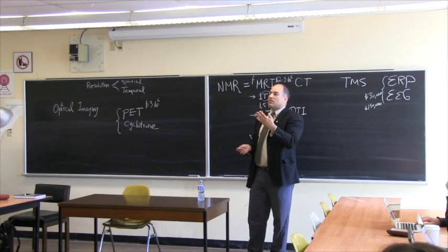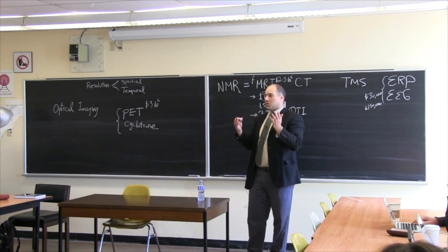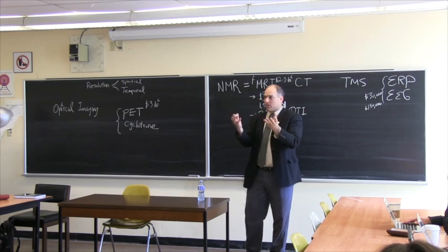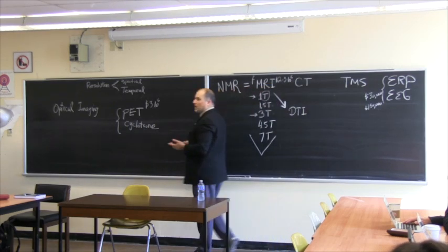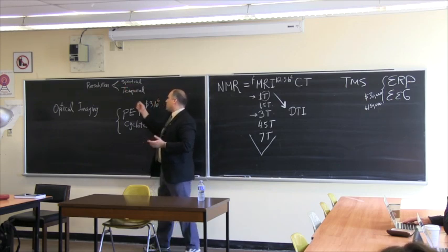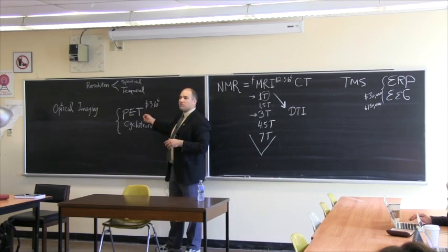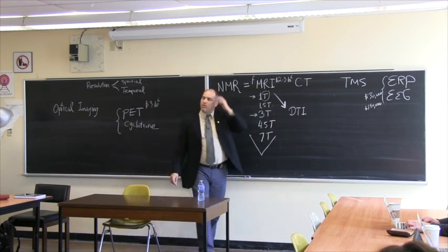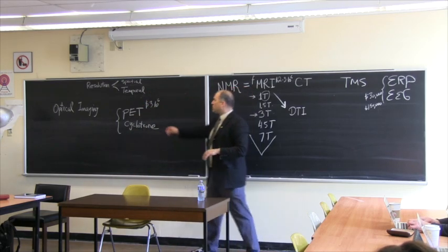What I'll show you later is that at some point it makes no sense anymore because the electrodes begin to interfere with one another, and there's a physical size to these things, and the heads are also not infinite. So there's a finite space to put all this equipment on. We are very close to getting to that limit. Spatial resolution of ERPs is on par or close to the spatial resolution of PET, more or less. It's crude, but if you are close to the top, if you're close to the cortex, it's pretty good. I would say, actually, I would revise what I said.